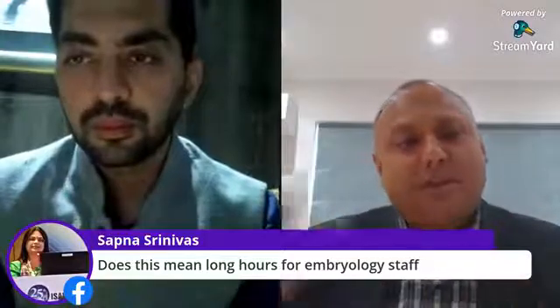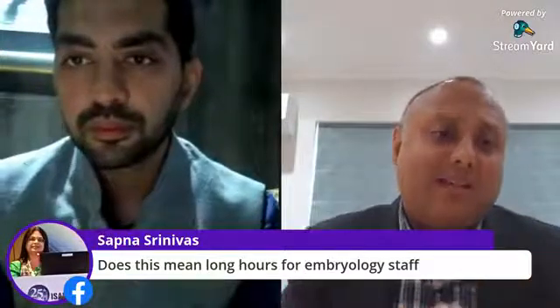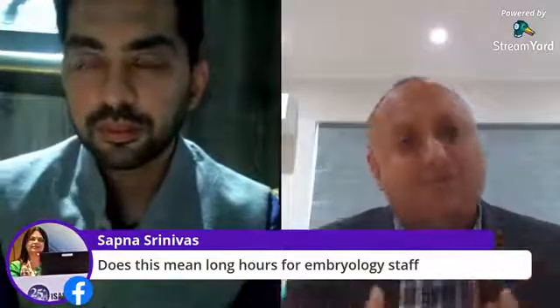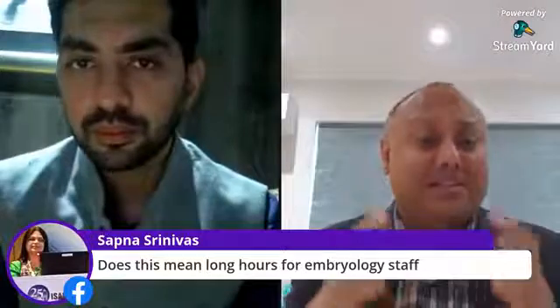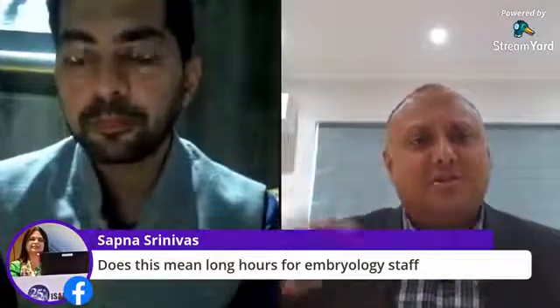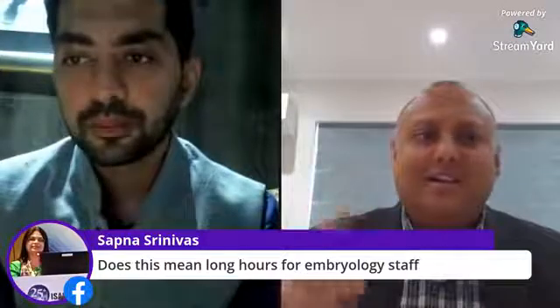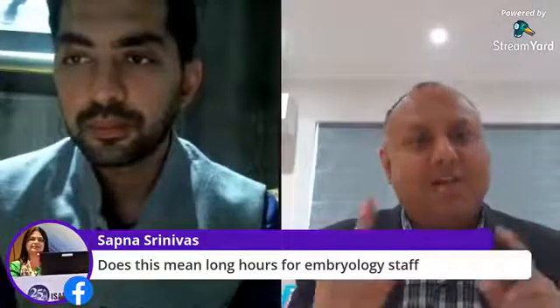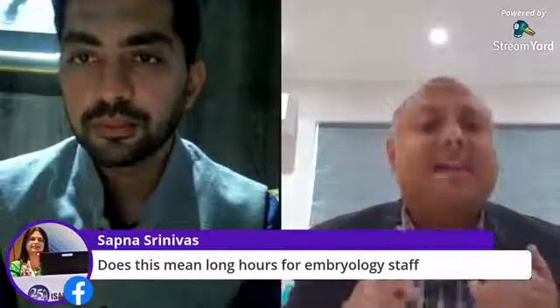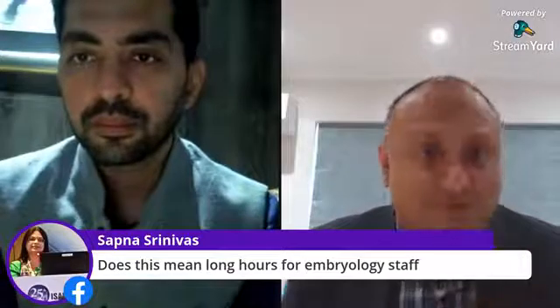Thirdly, how to minimize taking the dishes in and out. For clinics that have the added advantage of having time lapse, it is important that you really try and utilize your time lapse systems right now to prevent the dish going in and out, the operator handling in and out, multiple operators handling the same sample, etc. One thing that we know, which is good news, Keshav, is that there are no receptors on the egg, sperm, and embryos for COVID.